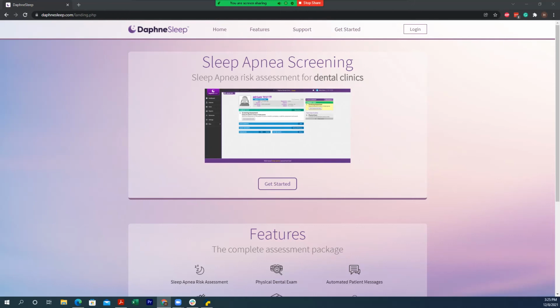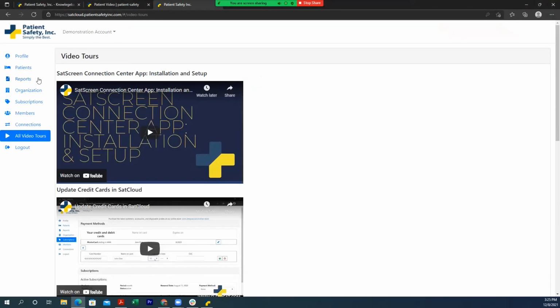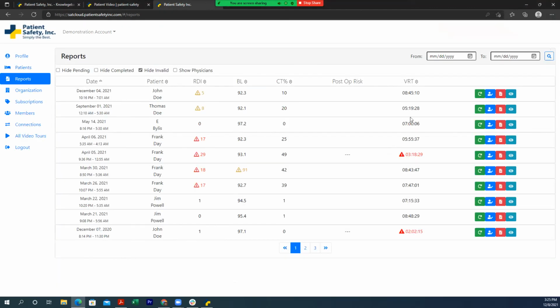Amy did have some good points, and I should go back and highlight those. The valid recording time can be a high-risk notification.